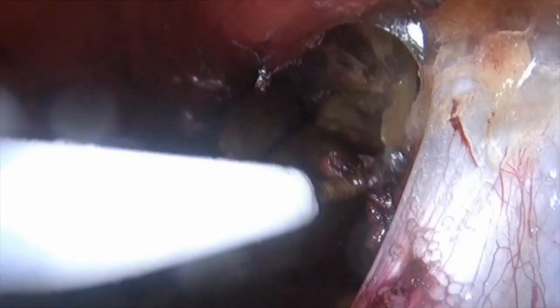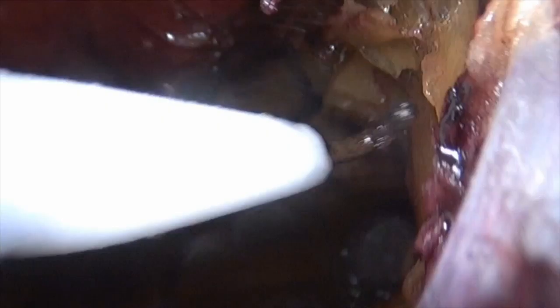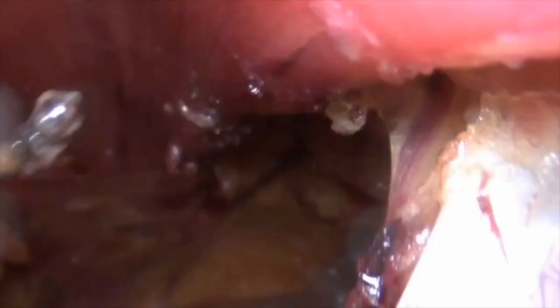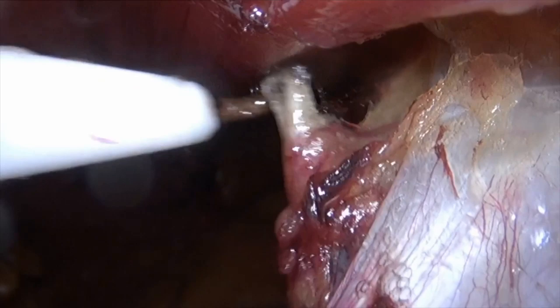and now we are just trying to dissect a little more fat, and you can see we are not able to see anything beyond that. So here we can see a little more fat which is present, and we are just dissecting once again close to the roof and not on the inferior aspect. If you go inferior, then we'll definitely cause buttonholes to the peritoneum, and that would really make your surgery a lot more difficult.